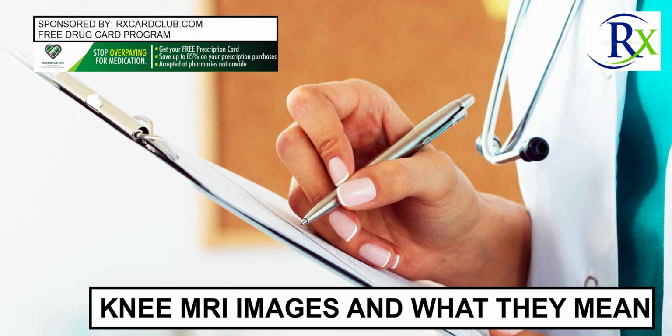The meniscus is a wedge of cartilage within the knee that helps cushion, stabilize, and transmit weight across the knee joint. If ever the meniscus is torn, an MRI may reveal that its typical triangular shape will either have shifted or changed. In some cases, the torn portion will have migrated to the center of the knee joint. This is commonly referred to as a bucket handle tear.